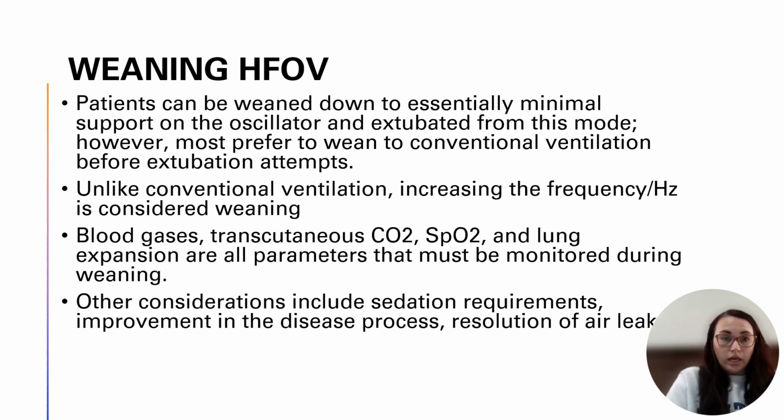All right, let's talk weaning. Patients can be weaned down to essentially very minimal support, essentially CPAP, and extubated from the oscillator. However, I've been doing this for 9 years. Only a handful of times have I seen providers actually follow through and wean down and extubate straight from the oscillator. Generally, they're going to wean down to bare minimum oscillator settings and switch over to conventional. So unlike conventional, when you're weaning, you're going to increase your frequency or increase your hertz, not decrease your rate like you would in conventional.